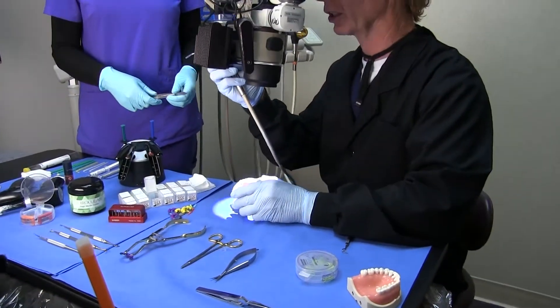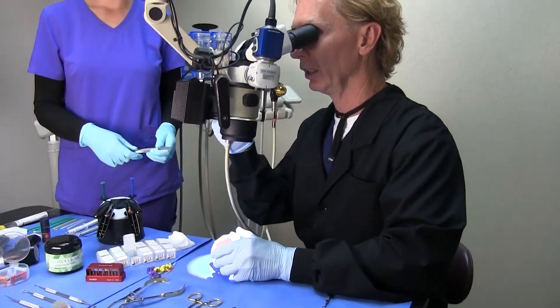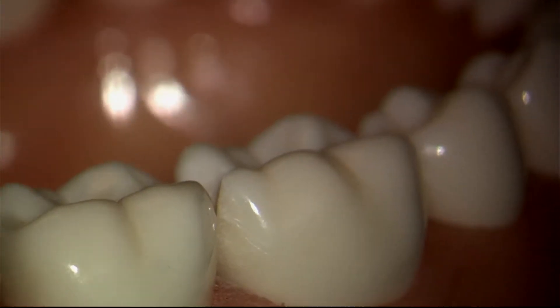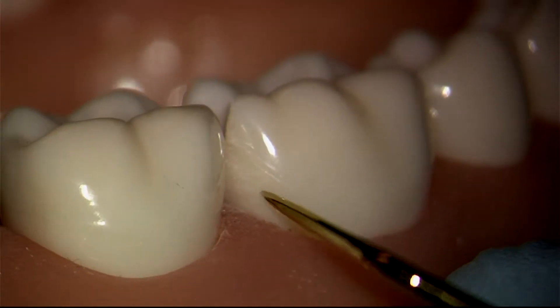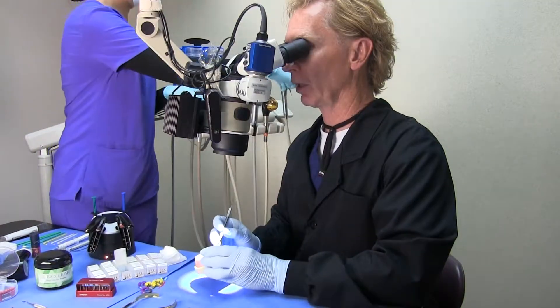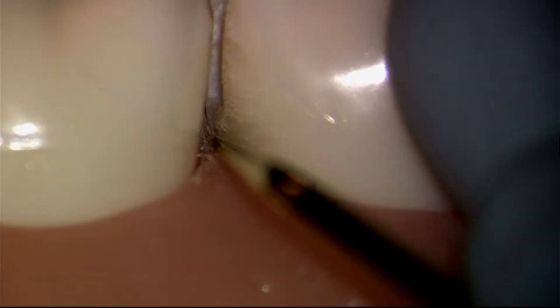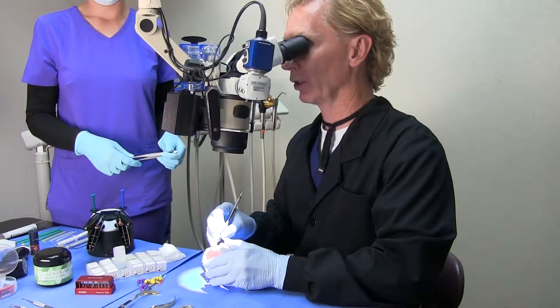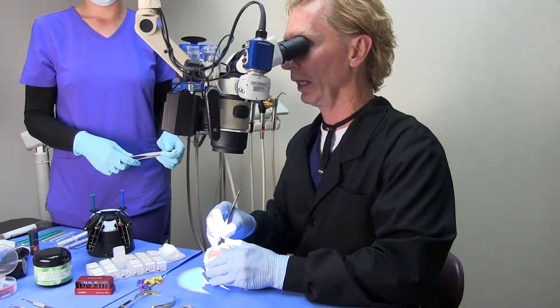You'll notice that the entire surface has been sanded all the way to the line angle. So now as we do our injection molding, we're going to allow the composite to truly wrap the tooth and engage all of that enamel, and especially the enamel at the gingival.